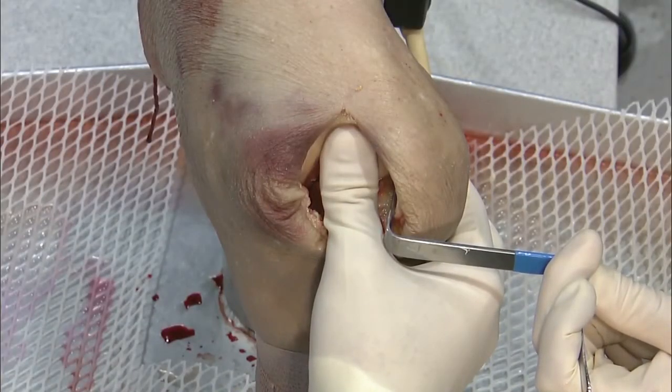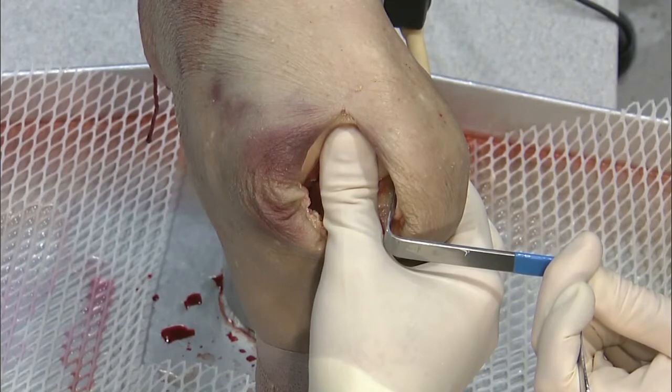But that point of having saline or even the media on your thumb is important, because if it has desiccated and your thumb's dry, you could end up with that scenario. Yeah, definitely would not want that to happen. I'll wait the full 3 minutes. Any other questions at all?